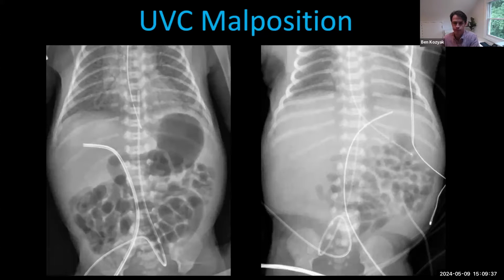I think we've all been there. You're pushing the catheter in and out, blindly feeding around, pushing on the liver, moving the baby around, trying to line over line, et cetera, but it still doesn't go in. You really don't know what you're doing, why it works sometimes, why it doesn't work other times, and it's a super frustrating experience. And you probably eventually curse in front of a baby, which you probably shouldn't do, and then give up, leave it low, and move on.